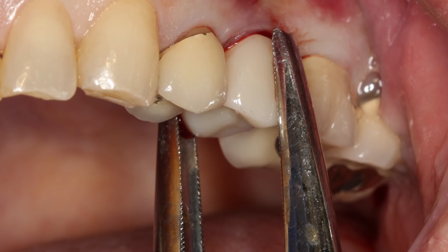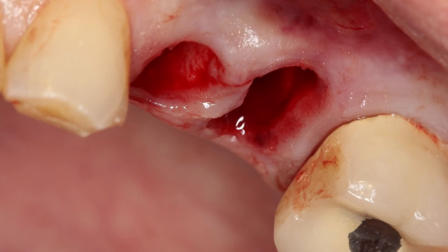No squeezing occurred during this process. Rather, simple rotational force was applied. The tooth was lifted up and out of the socket, thus maintaining the facial plate of bone. The instrument is intended not to remove the tooth in total, but rather to luxate it. A tooth delivery instrument was then used to remove the root structure in total. Visual observation and digital radiography demonstrated that the atraumatic extractions resulted in intact socket sites.